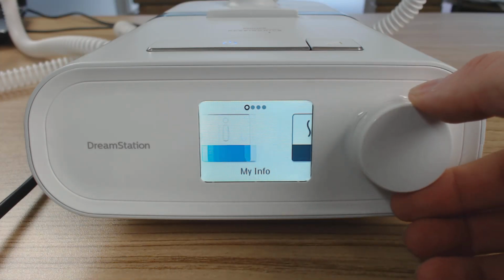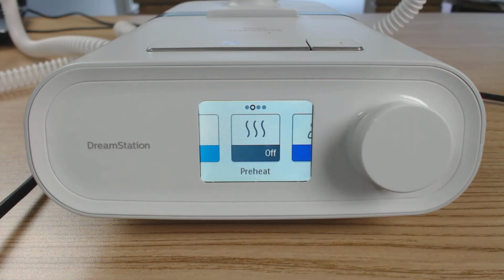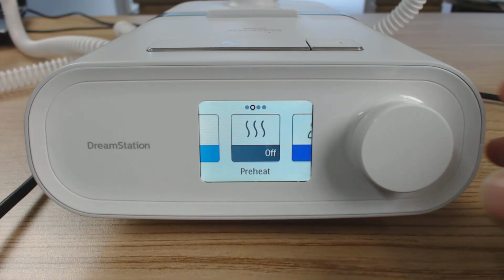Okay, so we're going to scroll one to the right. Preheat. Now, preheat enables you to preheat the humidifier chamber for 30 minutes so that when you go to bed, you instantly get humidification. Otherwise, if you just put your water in the chamber, put your mask on and hit the button, it's going to take probably about 30 minutes before that heater heats that water up and then starts delivering optimal humidification.